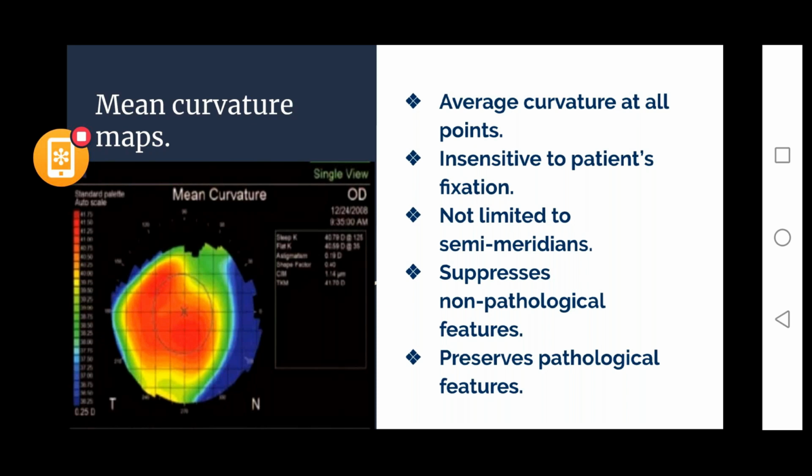So a paracentral ablation can be done for myopics or hyperopics and so on, whatever refractive surgery the patient is undergoing. Yes, it can be useful.